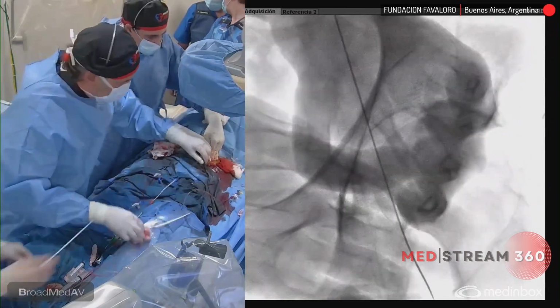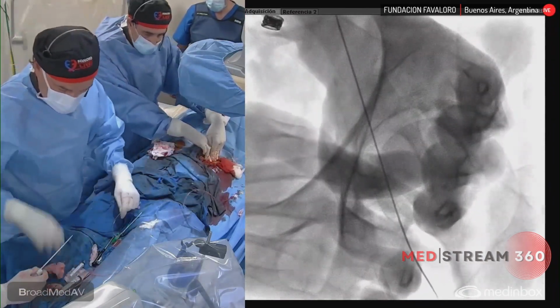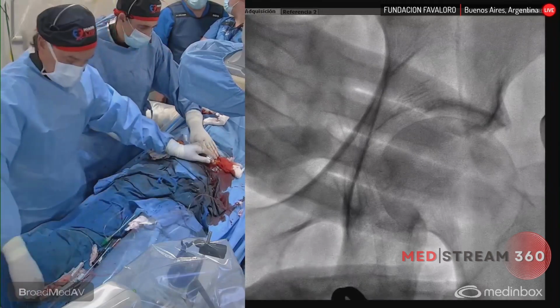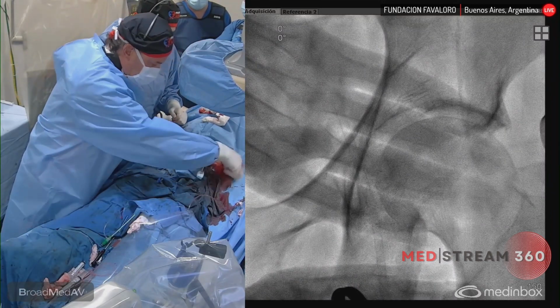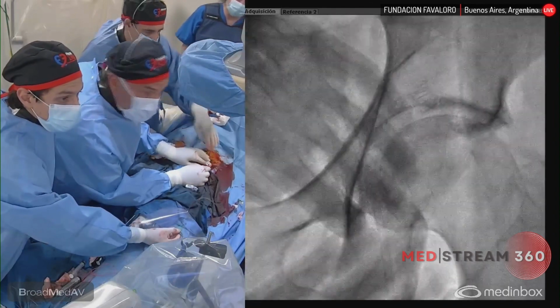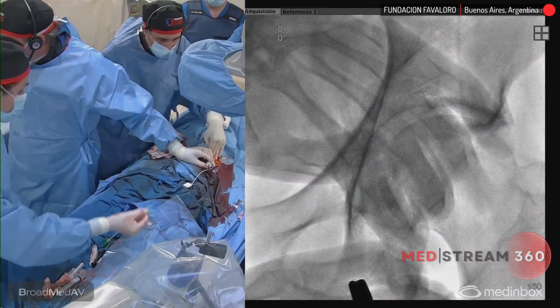Okay. So this was the reason why we have some bleeding there. Okay. Give me the Angio-Seal. It's here. Anyway, we are going to compress. We have a problem. Unfortunately, there was a kink in there. Probably this was the reason. And I destroyed the Angio-Seal.